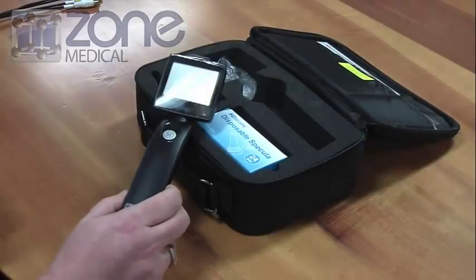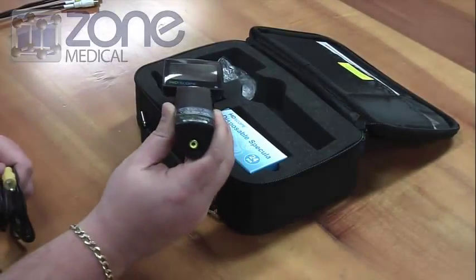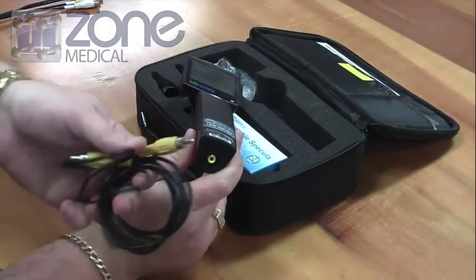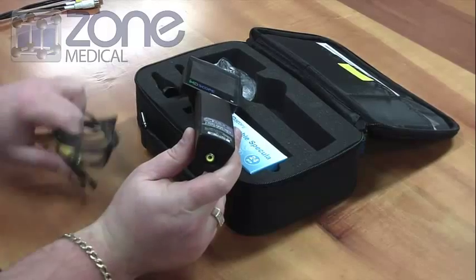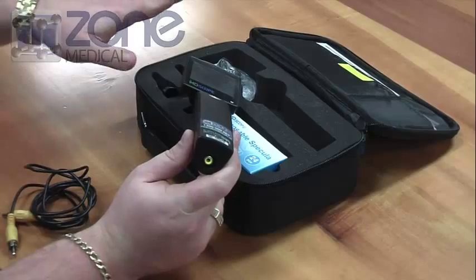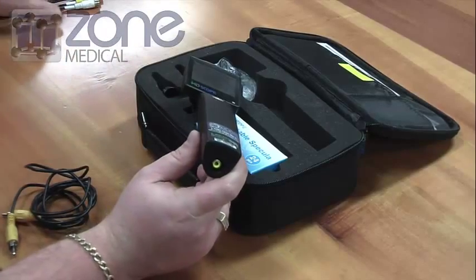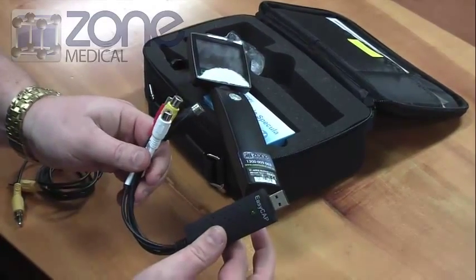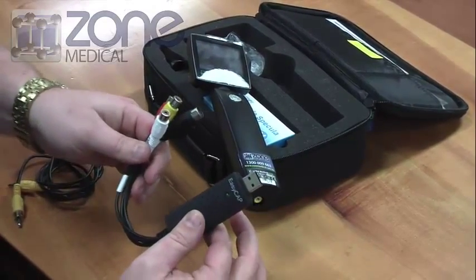The other available accessories for the Apple Otoscope are your video output. It comes with a video output lead, which is just a single RCA to RCA. It plugs in the bottom of the handle. You can plug into a TV for video projection, or you can plug into a USB capture device, which is available for purchase with the scope.